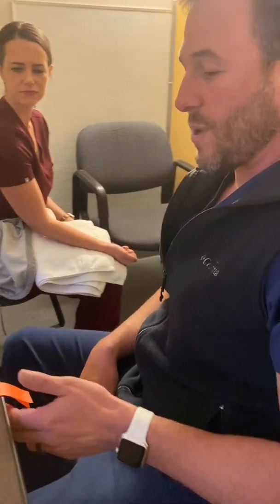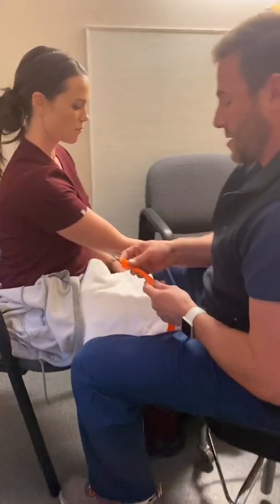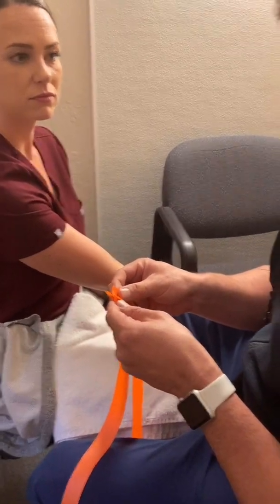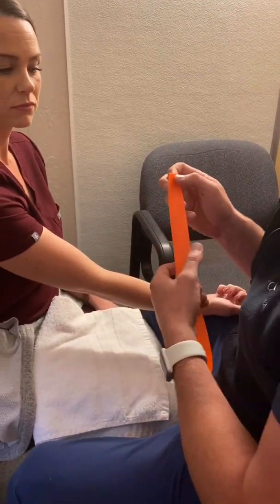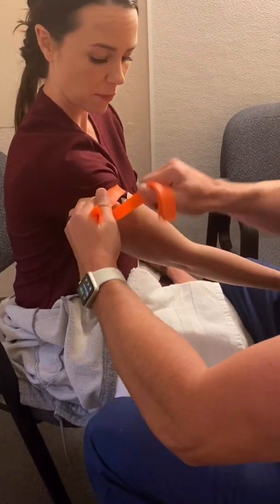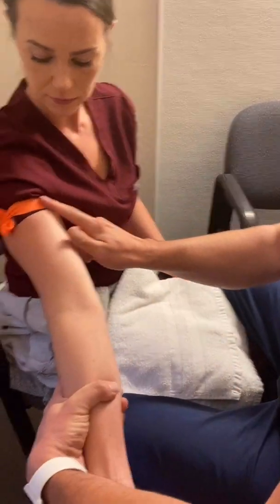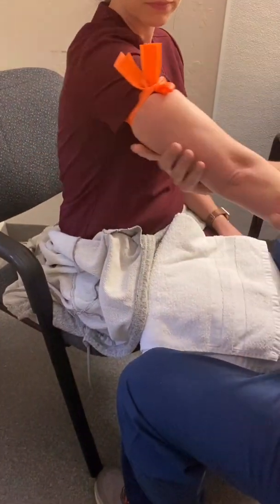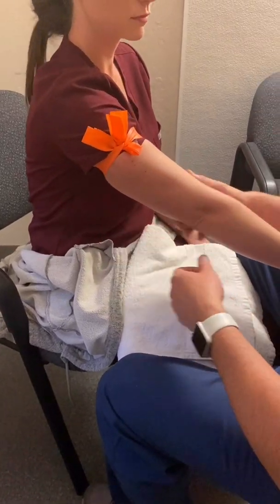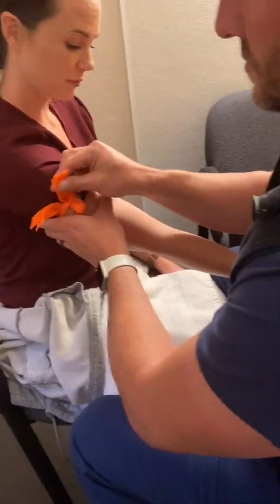So let's start off with tourniquets. If you notice, I like to have 2 of them. You don't have to, and it's not necessary. However, when you apply it, it goes nice and smooth all the way around the arm. I don't know if you can see that. It doesn't pinch the skin like one does. Plus it makes it nice and tighter. So I like having 2 tourniquets.